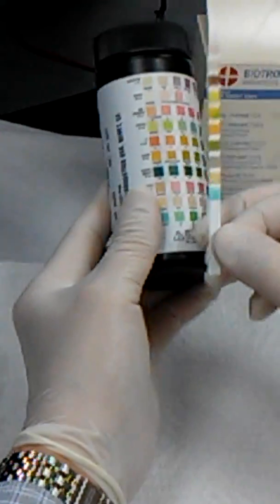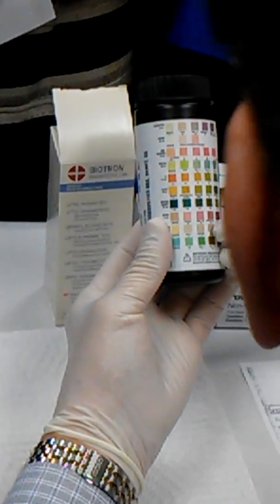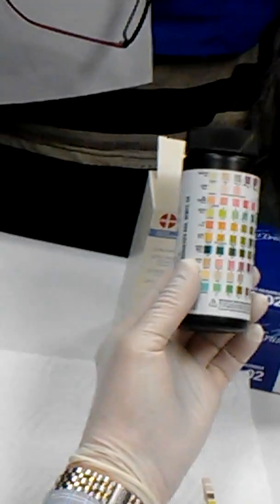You're comparing. Guys, do not touch it because urine is here. Next is urobilinogen. It's a strange color, and I don't think it's good. The strips are not good, so it's negative. So nitrites are negative, urobilinogen is negative.